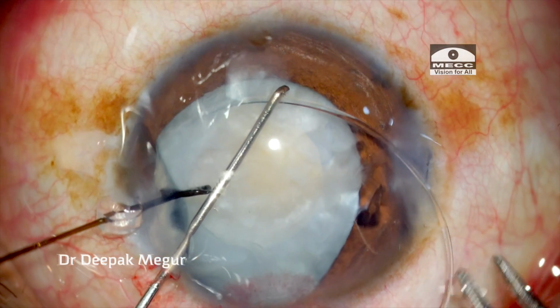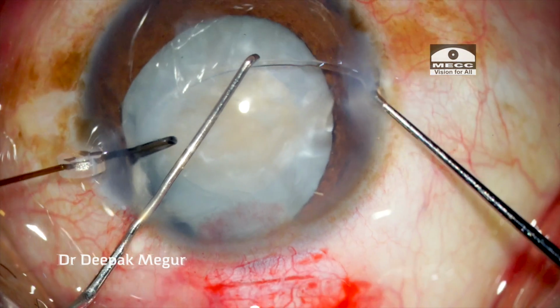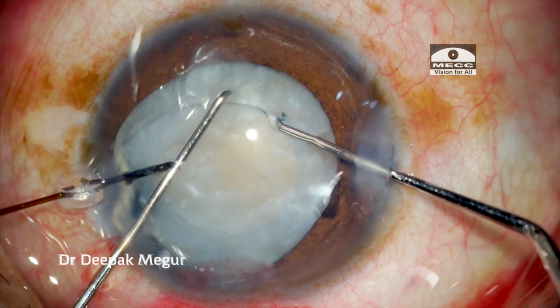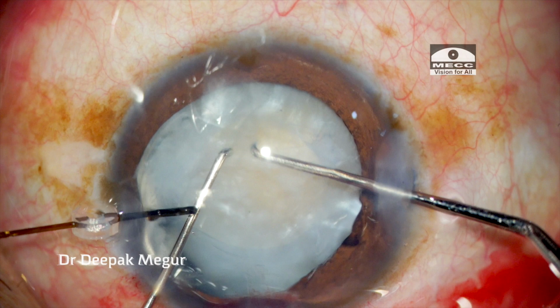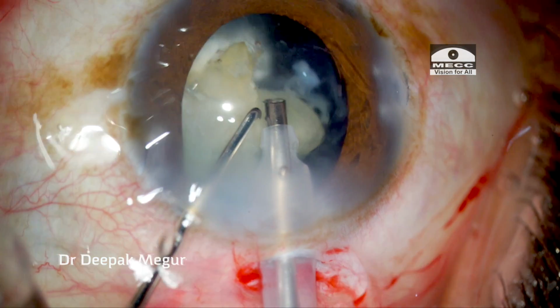The point to note here is the direction in which the CTR is being threaded and its orientation with respect to the zonular dehiscence. This is very critical for us to understand because we want to support the area of the zonular dehiscence first before moving the ring around and supporting the other quadrants. So once the ring is placed, again we are emulsifying the nucleus and the case is done.